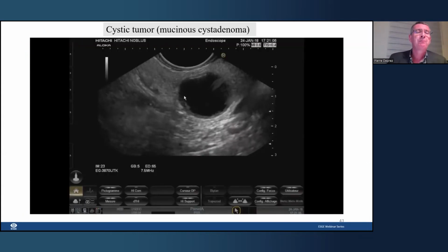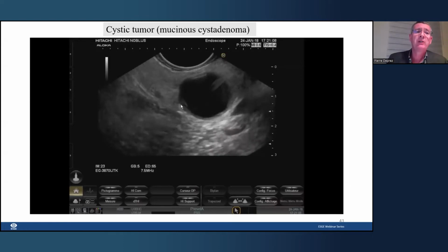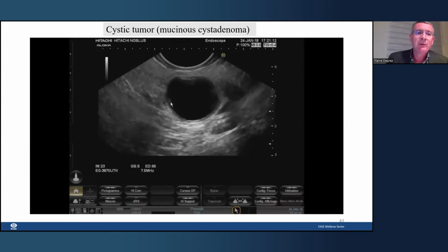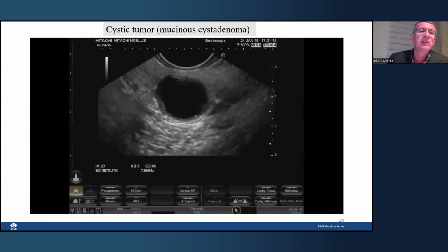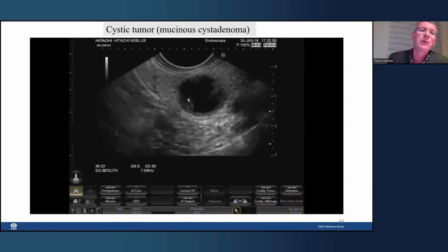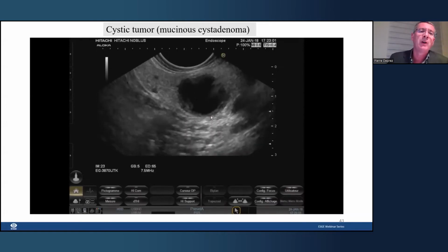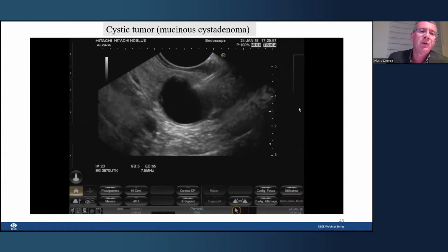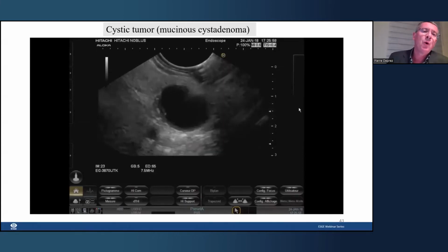Concerning radiofrequency ablation, this is a video coming from Marc Barthet's group. I think it's a very nice video, beautiful images, and you see this unilocular cyst between 2 and 3 centimeter diameter with a nodule seen on the opposite wall.